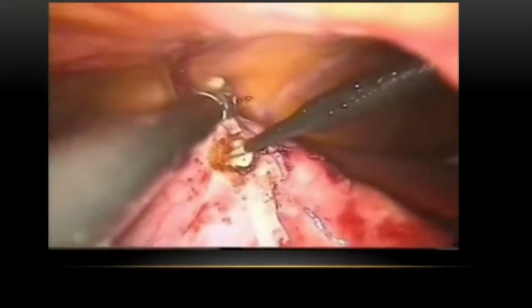So here this is the hook, and this hook is opening it slowly, and you can hook, look and cook, and slowly you can separate it. So ergonomically, in different situations, here it is the tripolar which is cutting and doing de-roofing. This is a tripolar which is doing de-roofing of the cystic anterior wall, and it is cooking and cutting the entire wall. This is de-roofing, and then you will go inside, and this is the germinal layer.